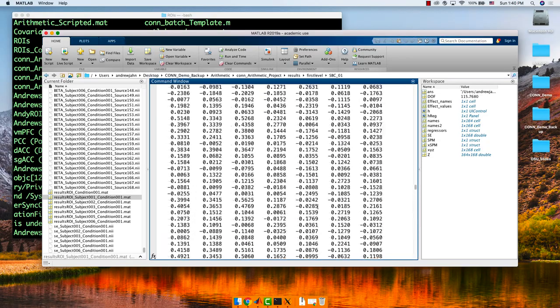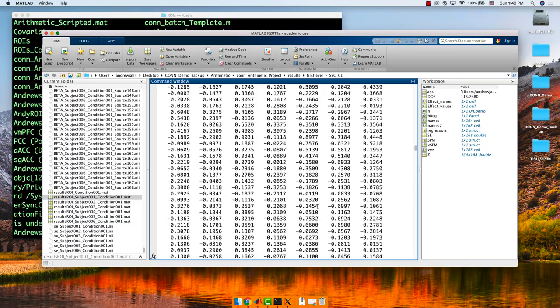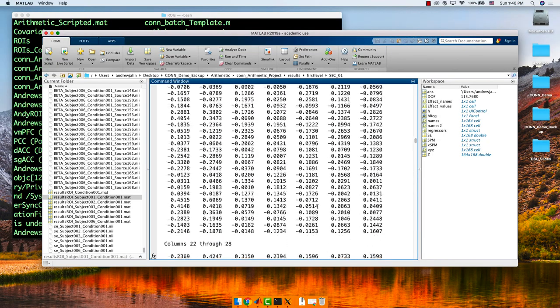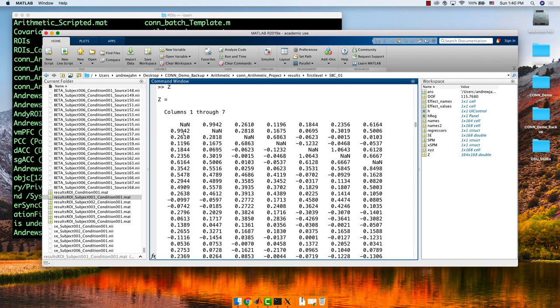Scrolling up, Z gives you the Z score — the correlation, the R-to-Z transformation for each of those ROI pairings. For example, the first ROI was frontal pole right, the second was frontal pole left. So you simply look at row one, column two. That's the Fisher-transformed R-to-Z score between them. All you have to do at that point — let's say that was the only ROI-to-ROI connection you were interested in — simply grab that for every subject and do a t-test, because these correlation values have been normally distributed by that transform. And that's really it. That is your result.